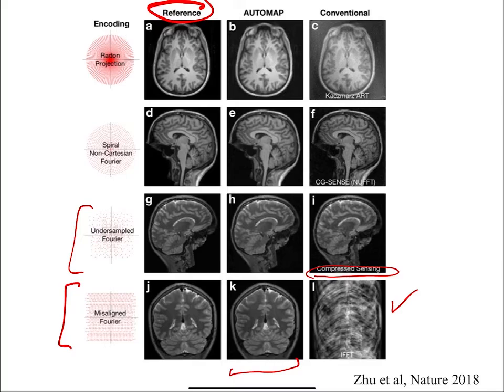Yep. Question. Is it able to reconstruct abnormalities? Yeah. It is. Which is sort of amazing because in these images it's shown it's never even seen in MRI images. But the thing is that biological things just tend to have certain features. Okay, so when you have a tumor, it's generally not going to be really spiky and noisy. It's going to have certain biological features.